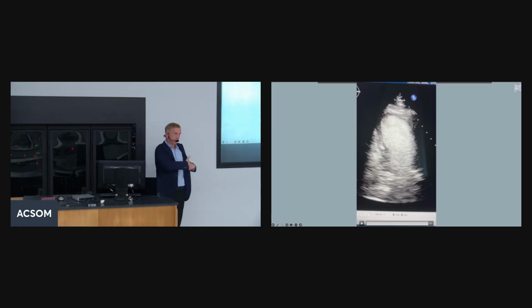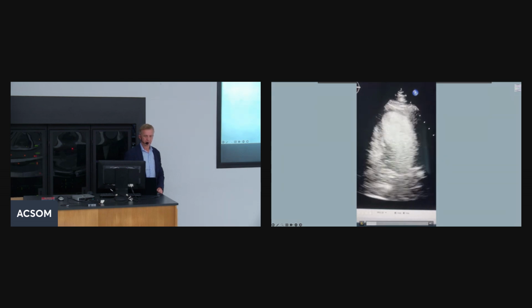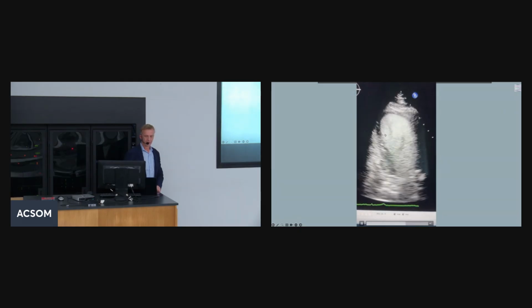Again, the probe is here under the breast, and it's the two-dimensional view focusing on the left ventricle. This is the interventricular septum. This is the anterolateral wall, and this is the apical wall. Again, swirling of the contrast, not good, a possible nidus for thrombus formation, and this apex is not squeezing well.